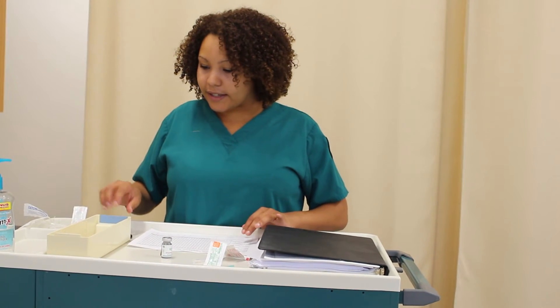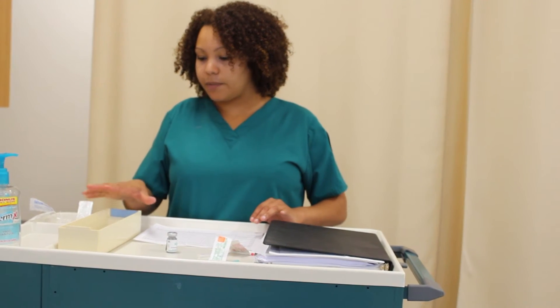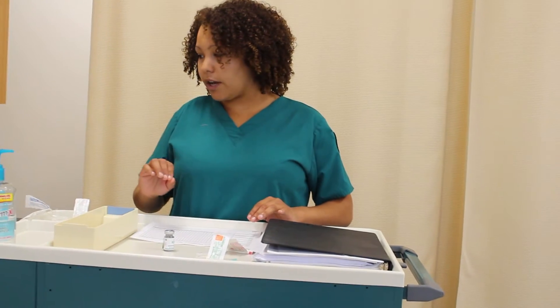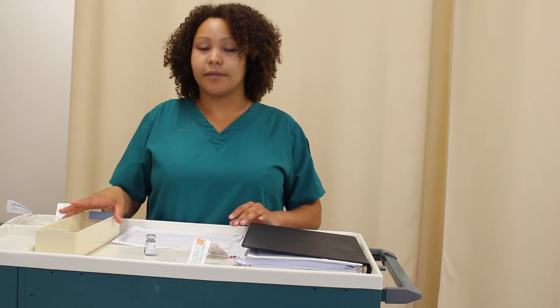The only things I need to take to the bedside are my labeled syringe, my alcohol swab, and some gauze. I'll take those and go ahead and administer the medication.